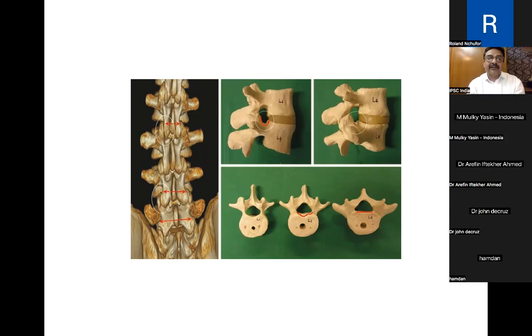Another important thing is that we go in a different direction. The patient lies in a prone position, the C-arm is in the AP position, and we are going from the posterior lateral side. This angulation is important, and it all depends on the level at which we are working. We discussed this in the anatomy lecture. It is not the same everywhere.